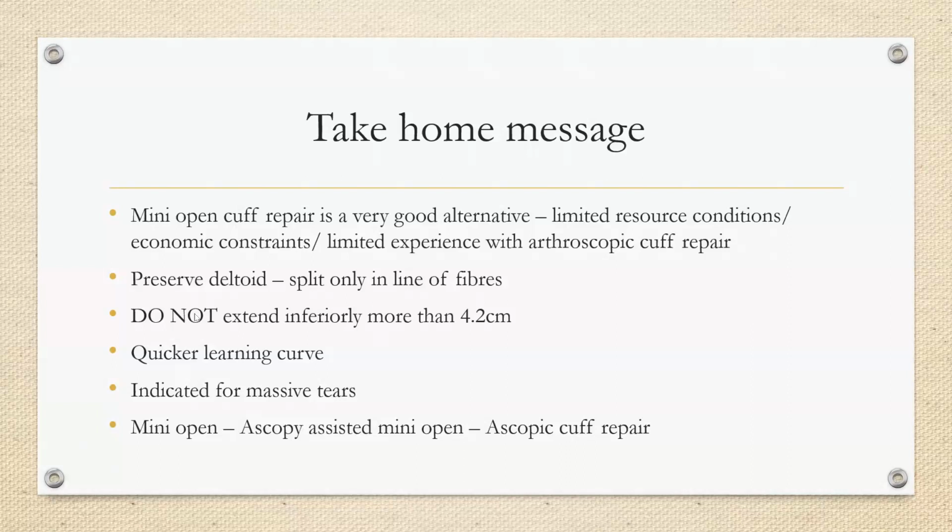The next most important advantage of open cuff repair in the current scenario is when you're dealing with an osteoporotic bone. Say, for example, you are approaching an osteoporotic bone for a cuff repair using an arthroscopic technique, and all the anchors pull out, and you don't have any other option to put the anchor in its proper bone bed. Then you are left with limited space, and you don't have any options to fix the anchor onto the bone. In such cases, you need some bone cement, some cemented anchors or vented anchors into which you can apply the cement and fix it. And all this is a time-consuming process with the saline irrigation which is happening. That becomes a trouble. So in such cases, doing a mini open and securely fixing either an anchor or bone cement and repairing the cuff is a better option when you're experiencing trouble in osteoporotic bones with suture cut through or anchor cut through.